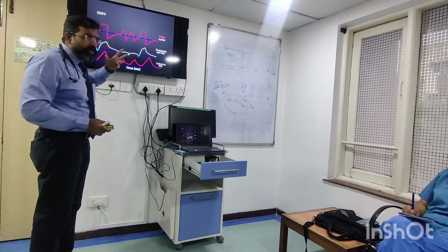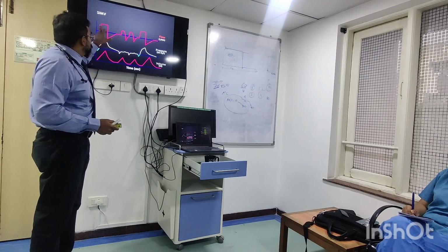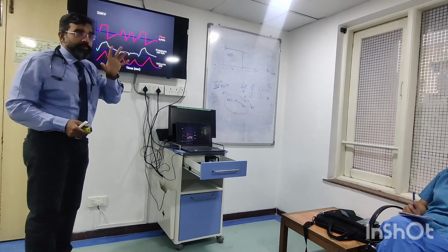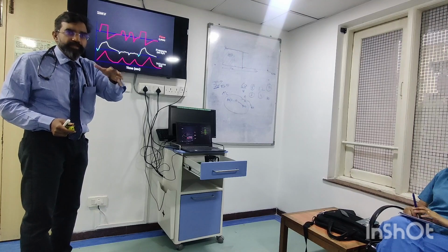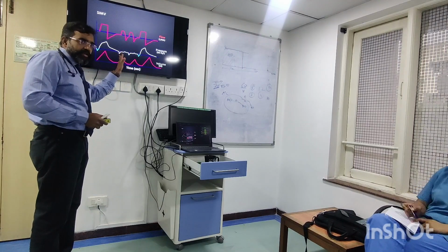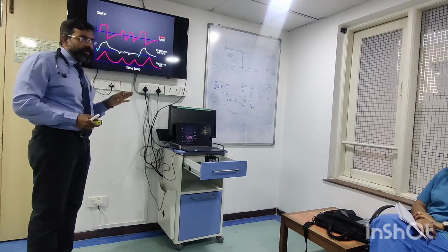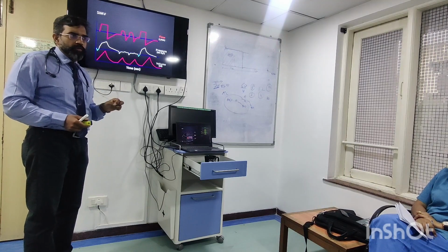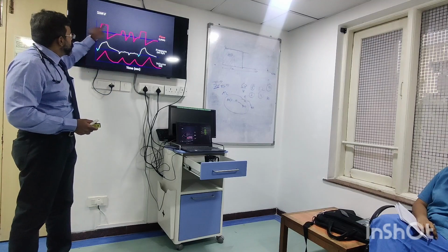Right. The other clue that you can get for exam purposes is constant flow. Otherwise, there are ventilators in which we can actually change the flow characteristic. But for exam purposes, when this graph comes in the exams, you have to call it volume control mode. More often than not, 90% of the ventilators, when they are on volume control mode, will deliver a constant flow wave pattern.